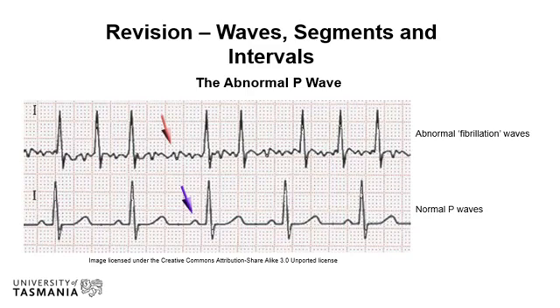When the atrial muscle fibres contract independently, there are no P waves on the ECG, only an irregular line, as we can see in the example on screen. The AV node is continuously bombarded with depolarization waves of varying strengths, and depolarization spreads at irregular intervals down the bundle of His.